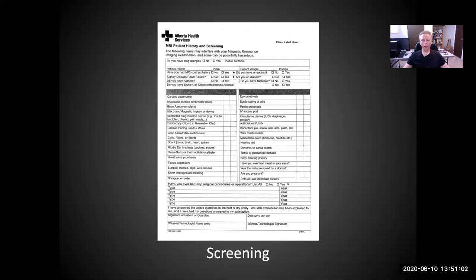Hearing aids, here you have to be careful because hearing aids are often not easy to see, and people forget about them when they are wearing them all the time. And so we have to be sure that they're removed before the person goes in, not because it's a danger to that person, but because the hearing aids could be destroyed by the magnetic field.